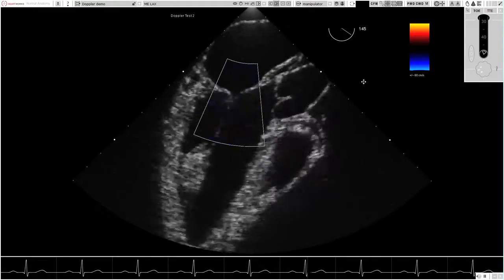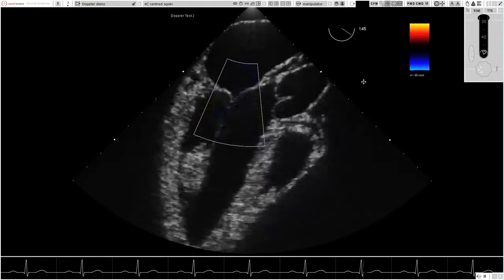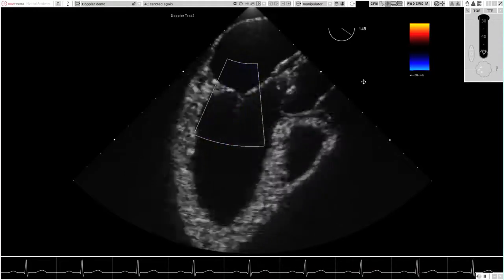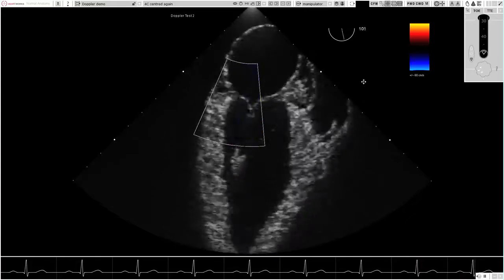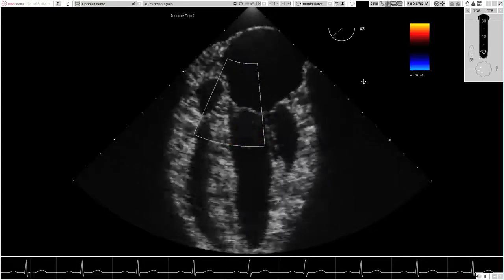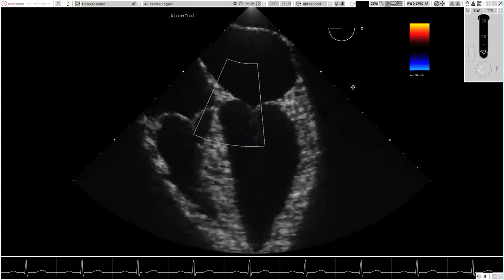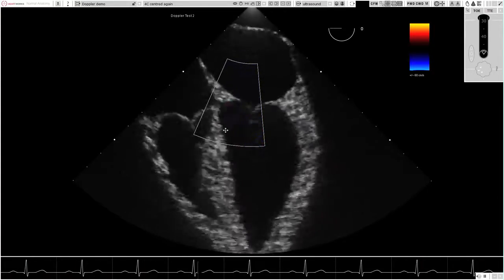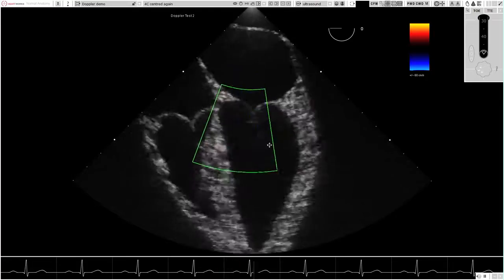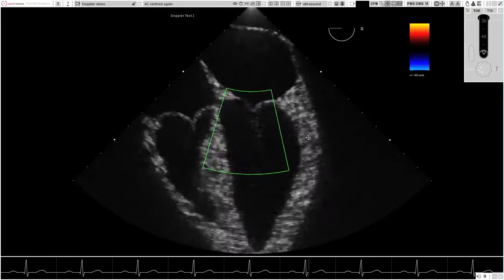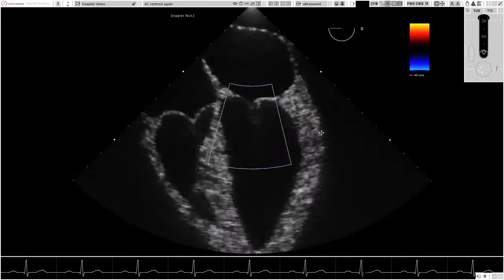Accurate seven-dimensional Doppler data has been inserted into the chambers of the existing 3D heart model to represent flow directions and velocities, allowing an unparalleled degree of interactivity.